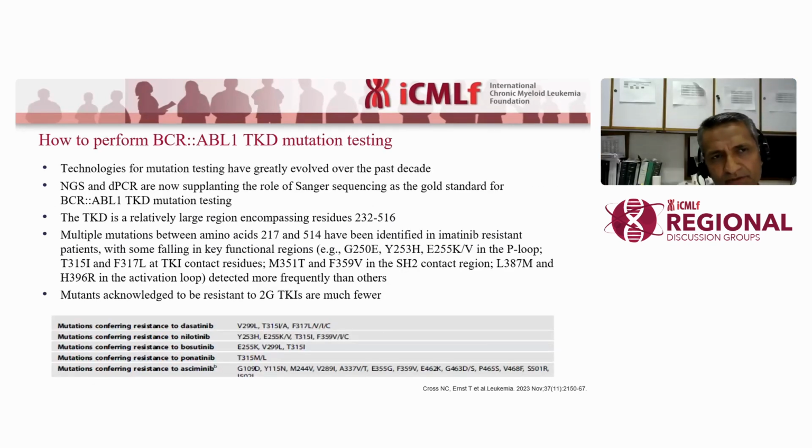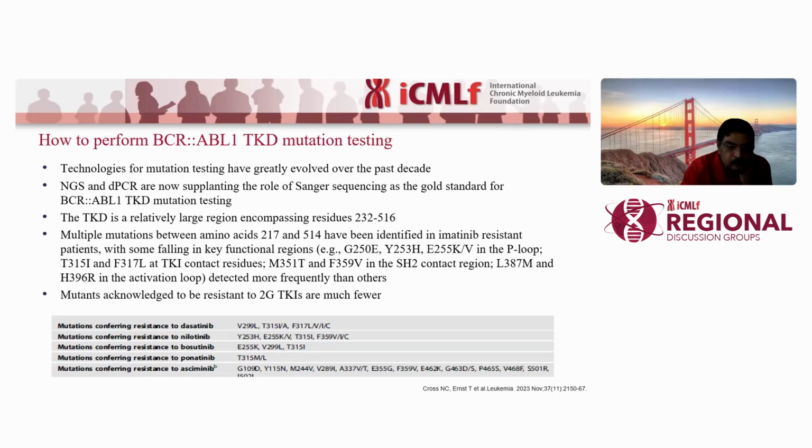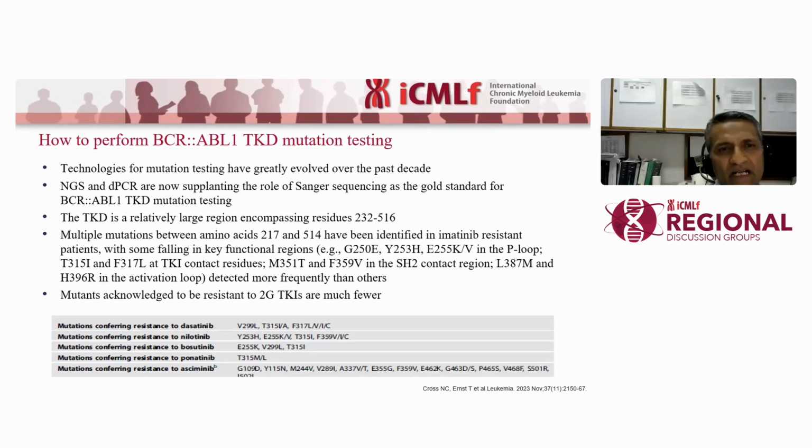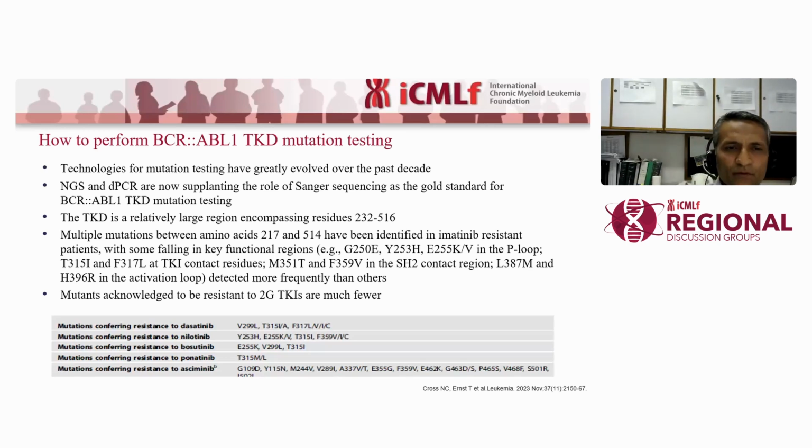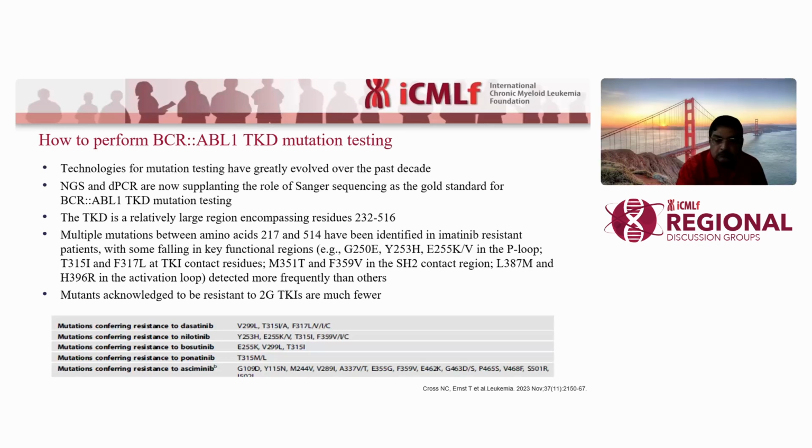This is how to perform. The technology of these mutations has evolved greatly since the last decade. NGS and digital PCR are now supplanting Sanger sequencing as the gold standard. These are a few of the mutations which are reported in the literature.